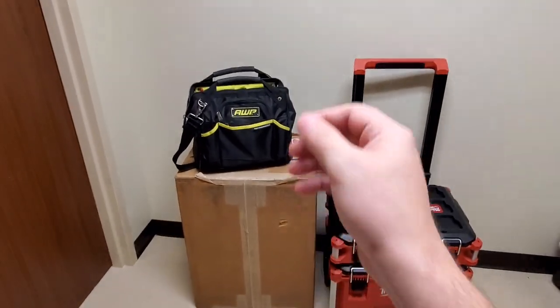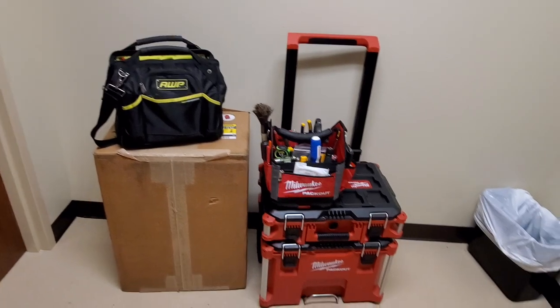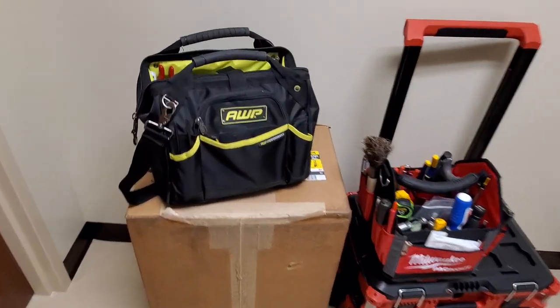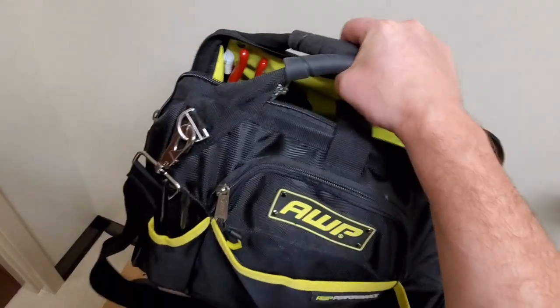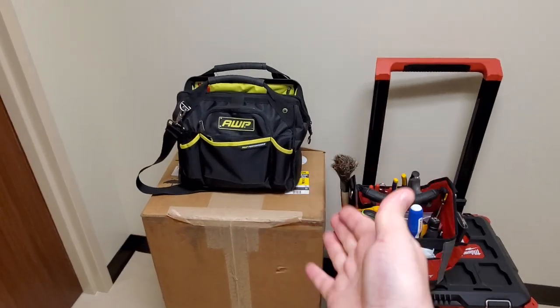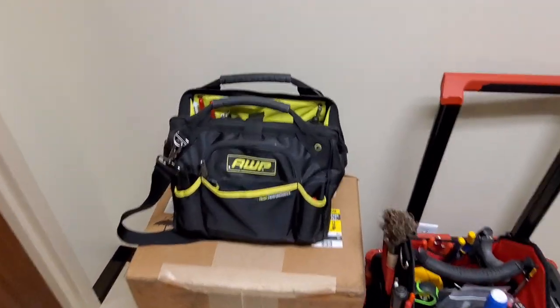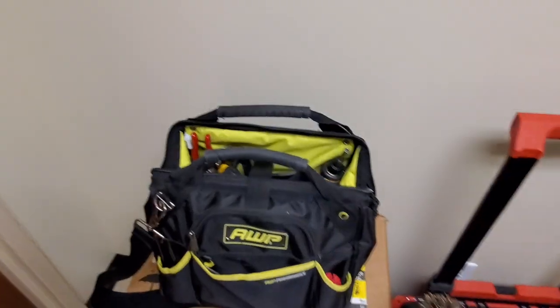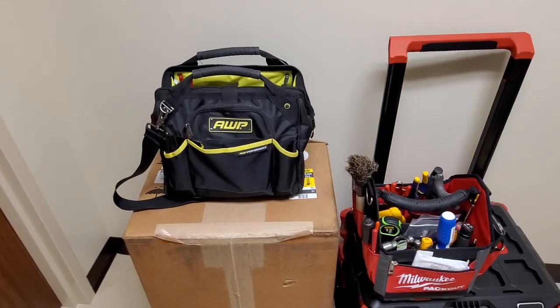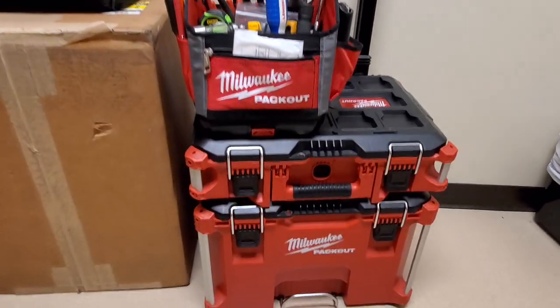This is my original tool bag — it's an excellent bag, built like a tank. But that bag is extremely heavy. The shoulder strap wasn't so bad, but you're bogged down and can't carry equipment back with you. There's a lot of stuff I couldn't fit down into the bag, and my multimeter was just crammed in the top — not a good idea, because somebody can just walk off with it floating on top.